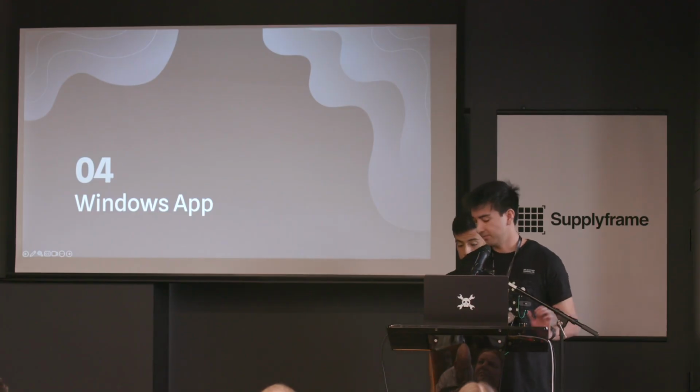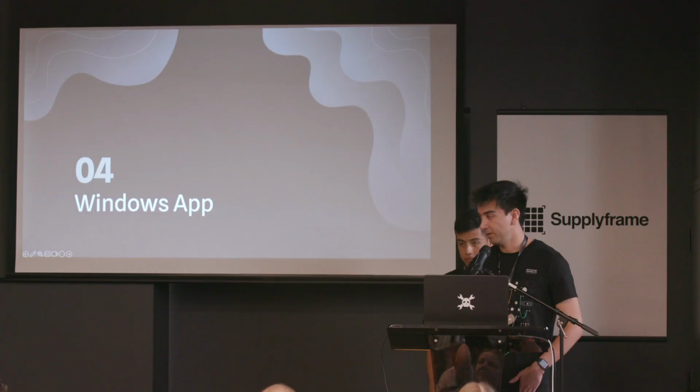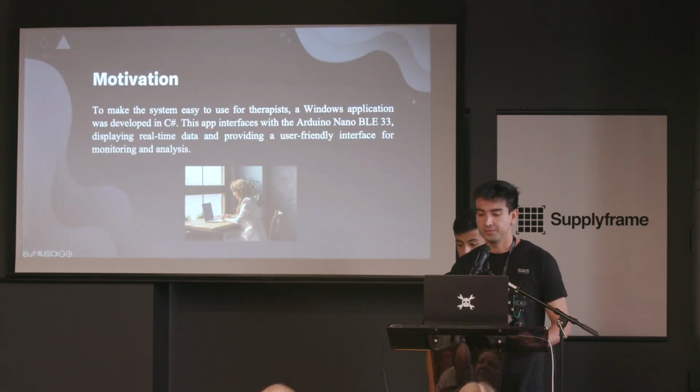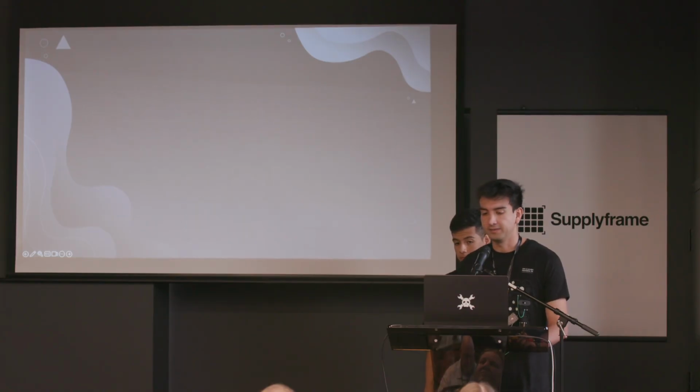Okay, so when talking about the Windows app, to make the system easy for therapists to use, we developed a Windows application using C# that interfaces with the Arduino Nano and displays the real-time data, providing a user-friendly interface.